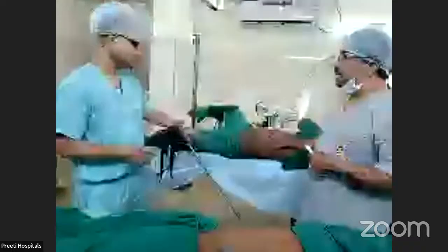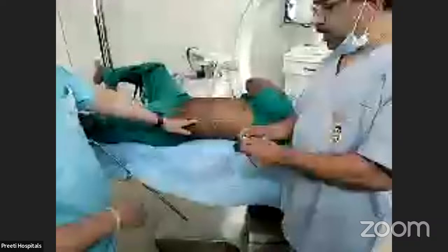Whereas in supine PCNL, the puncture is horizontal, parallel to the ground. Can you show that horizontal puncture like this? The puncture like this. Horizontally. At the last moment, we can change the needle direction. How will you change it? Just like this, we can change.